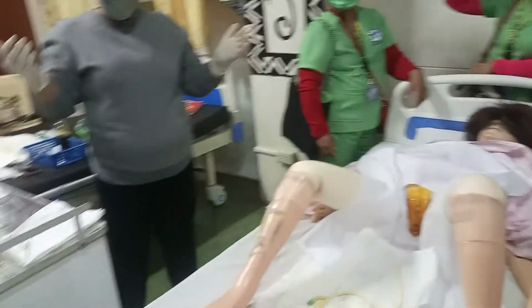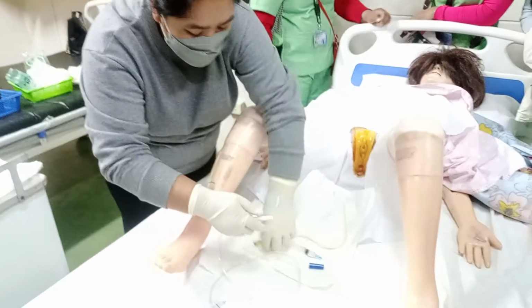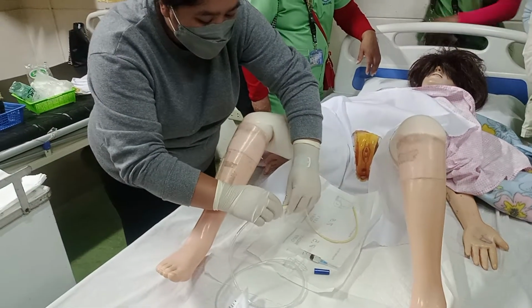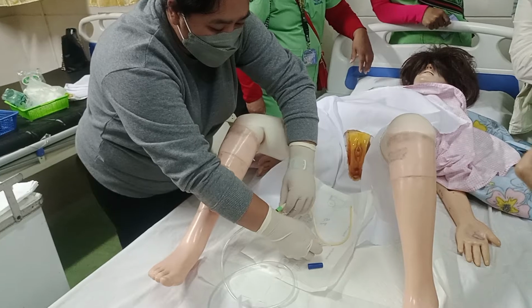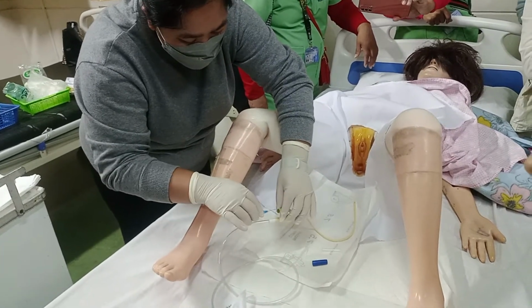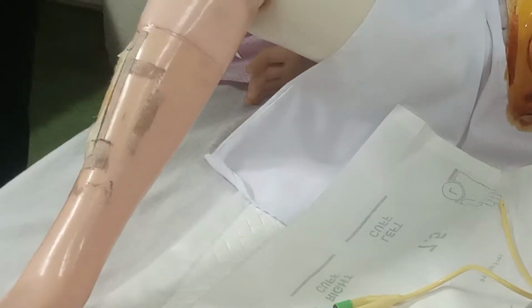Okay? Next, I am going to assemble now my equipment or my materials. Yung softer part ng inyong catheter, doon nyo ilalagay yung ating urine bag. Okay? Open it. Then, humawak lang kayo doon sa colored part. Okay? Pakiramdamang mabuti. Right. So, there you go. I am now ready to insert.